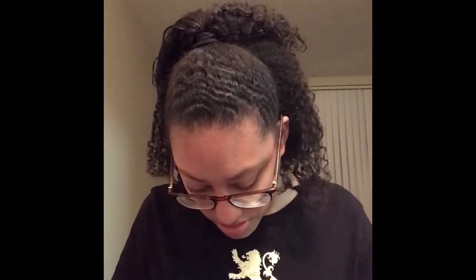So now that we have done that, we are going to measure our wound. You want to make sure that you are measuring your wound in centimeters. You also want to make sure that you are not touching your measuring device to the wound. So first we are going to measure length. So I would say that this wound is 7.5 centimeters. We are also going to measure the width, which is about 3 centimeters.